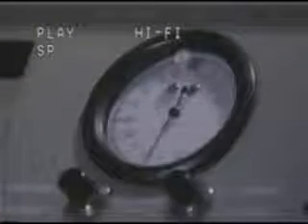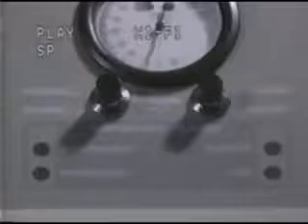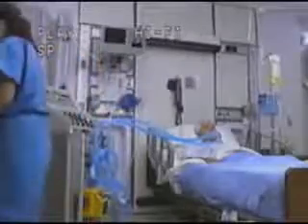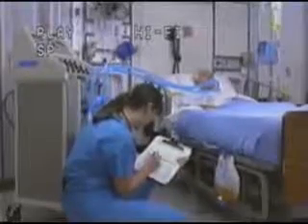As a critical care nurse, you'll be responsible for verifying the ventilator settings, including the FiO2, tidal volume, mode, rate, and anything additional, such as PEEP or pressure support. Make note of the peak inspiratory pressure and the temperature within the system, and check to see that the alarms are on. Patient safety is, of course, a #1 priority. Each day, the patient is weighed and intake and output is calculated to assess the fluid balance.